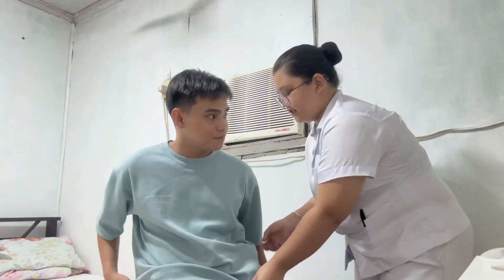Thank you so much for your cooperation, sir. After that, I will now be doing the aftercare. I will remove my gloves and dispose of the items in the appropriate waste receptacle. Next is to return other equipment. Hand hygiene assists the effectiveness of the medication at the time it is expected to act.